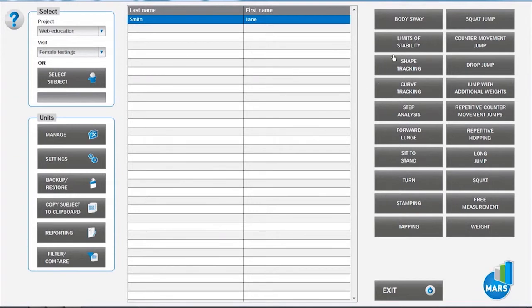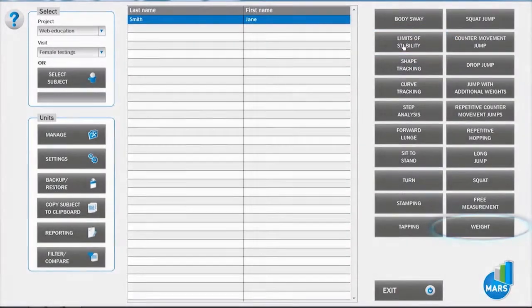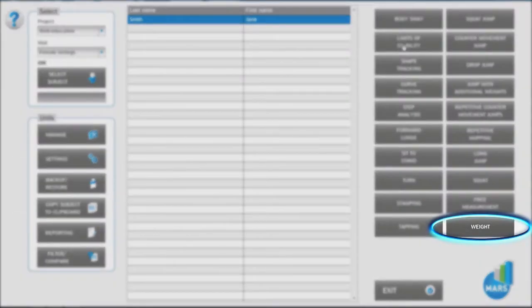Enter the limits of stability test module from the main window by clicking on the limits of stability button. Make sure you have acquired the subject's body weight beforehand.